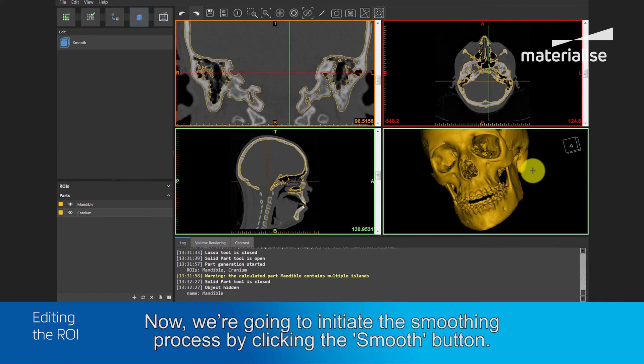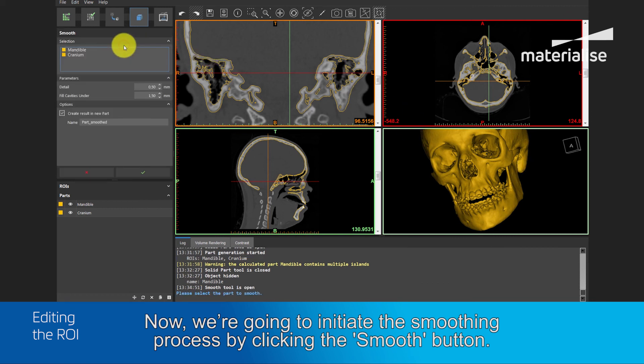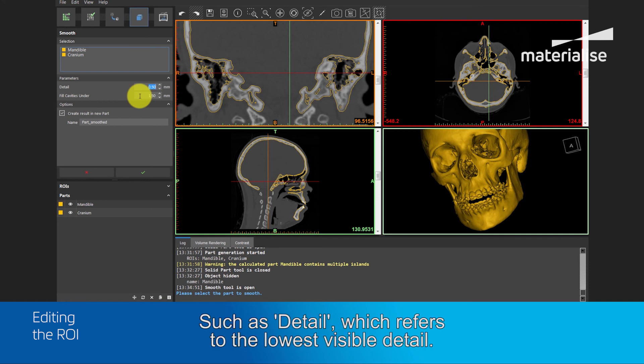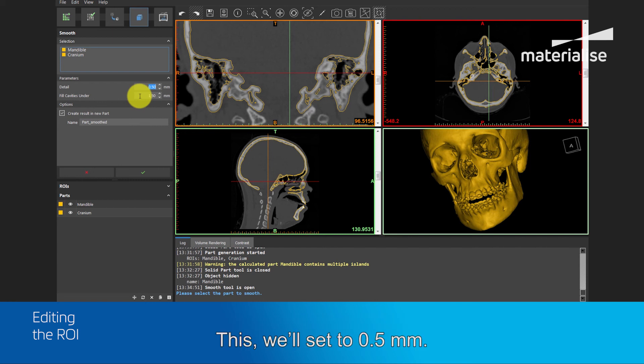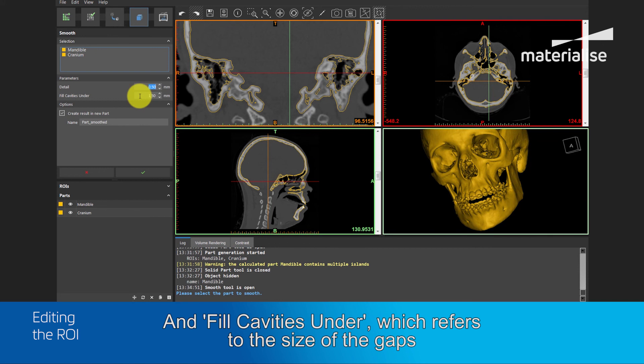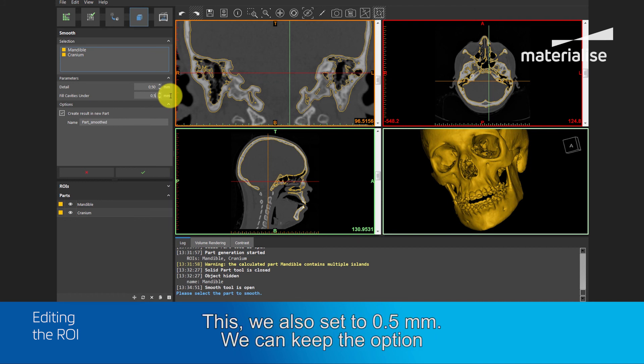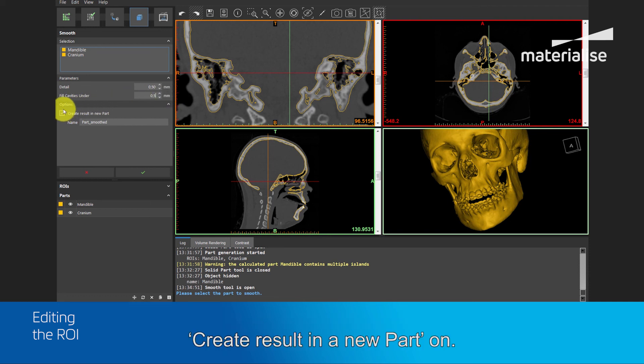Now, we are going to initiate the smoothing process by clicking the smooth button. After selecting the part, we can give values to different parameters, such as Detail, which refers to the lowest visible detail. This we will set to 0.5 mm. And Fill Cavities Under, which refers to the size of the gaps that are filled after smoothing. This we also set to 0.5 mm. And we keep the option Create Results in a New Part on.